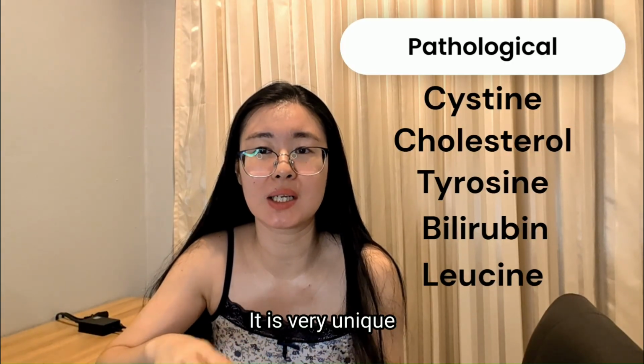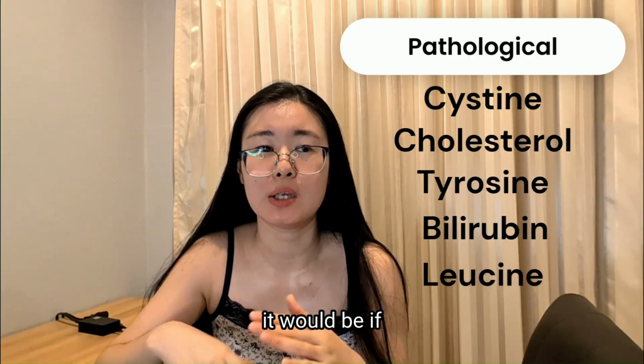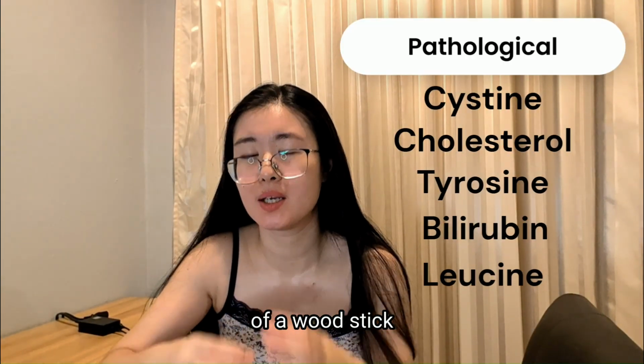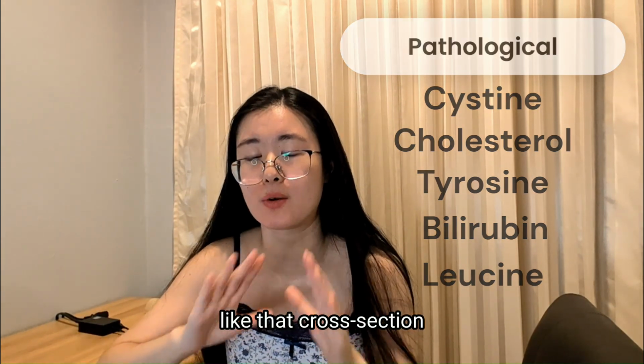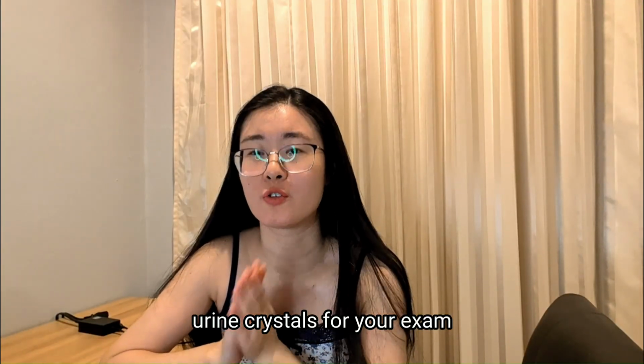It is very unique. If I have to describe this with something you can see in your day-to-day life, it would be a cross-section of a wood stick. I mean, a whole round wood stick. If you just cut it, it will look like that cross section. So those are the pathological urine crystals for your exam.